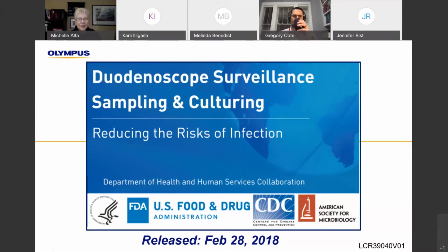Yeah, I was just going to add one last comment: everything that Gregory said makes total sense. Keep in mind, though, that even the FDA, I think, was surprised when they did the 522 post-market surveillance clinical assessment of the extent of endoscope or duodenoscope contamination. And they themselves reported that 5.4% of all of the duodenoscopes that were cultured from many different endoscopy clinics in the US had high concern organisms, and that 3.6% had low to moderate concern organisms, at levels that would be unacceptable.